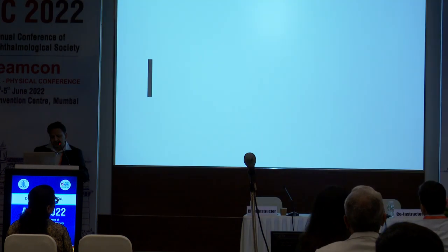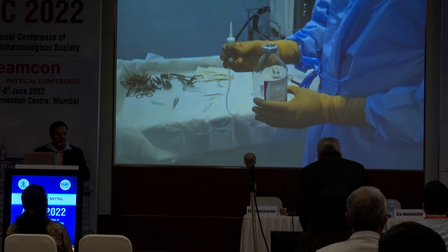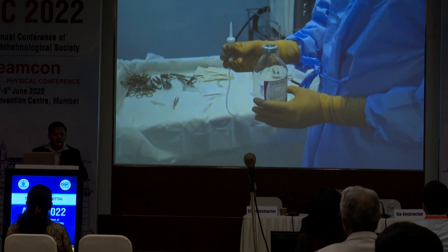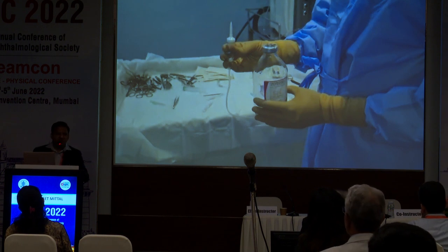So this is the last video I'm going to show. In Indian settings, many times we use the same cassette and the same bag for doing vitrectomy, and generally we keep the endophthalmitis cases as the last because it could spread infection. And if we send the same bag for the sampling, it may give a lot of errors.